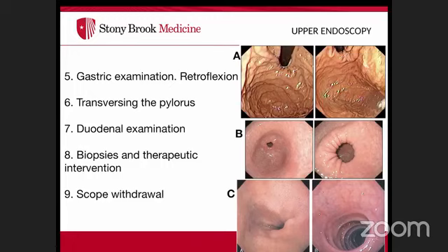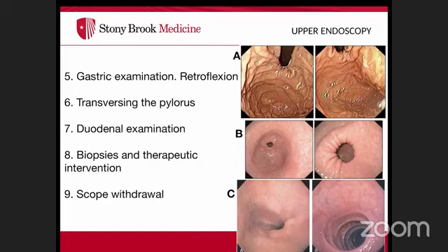Once in the second portion of the duodenum, you'll see more bile and can visualize the papilla. Take any necessary biopsies or perform therapeutic interventions. On withdrawal, suction air to reduce post-procedure bloating. Document with photographs throughout. Use biopsy forceps for small samples; use a snare for larger lesions.